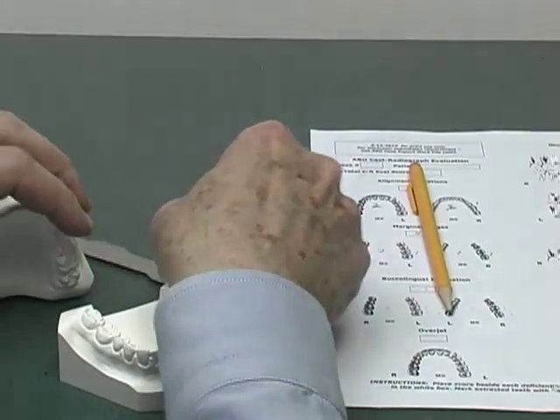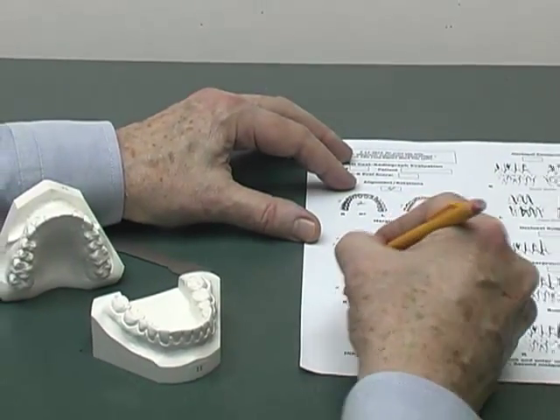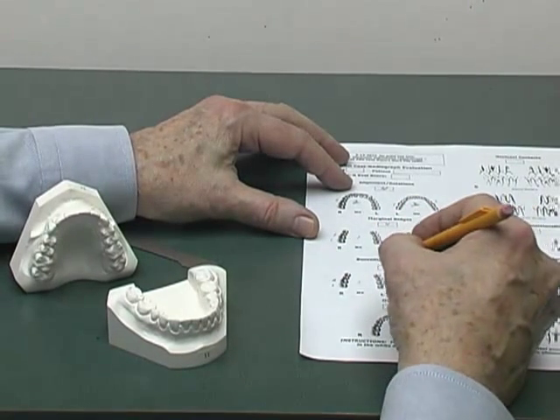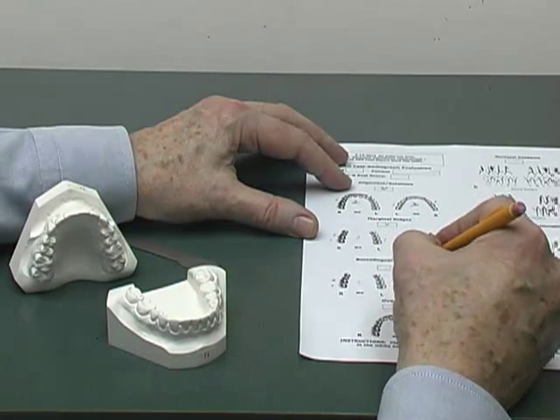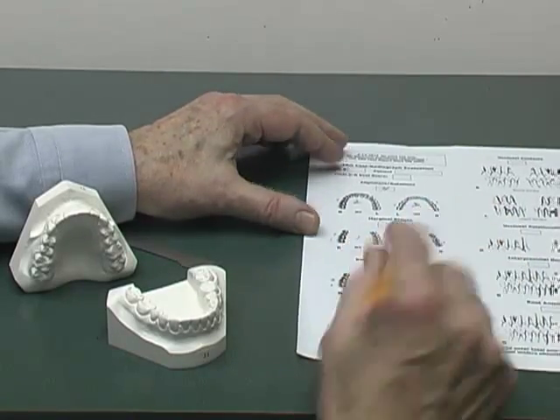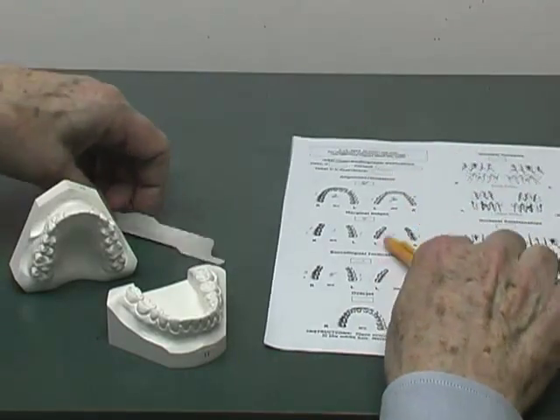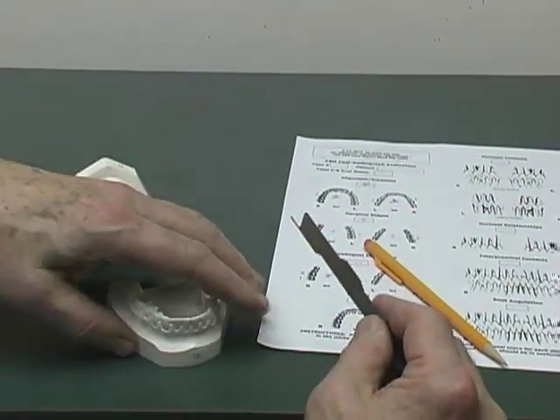So I'm going to record these maxillary scores: 2 on the upper right, 1 on the upper right second, and 1 and 1 for both the molars on that side. So that's a total of 5 for that particular maxillary model. Now let's move to the mandibular arch.